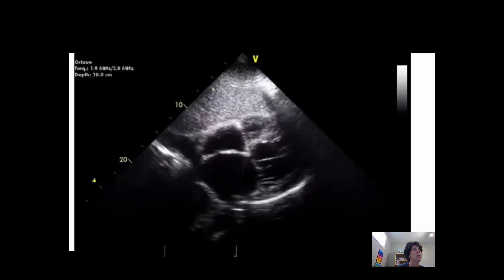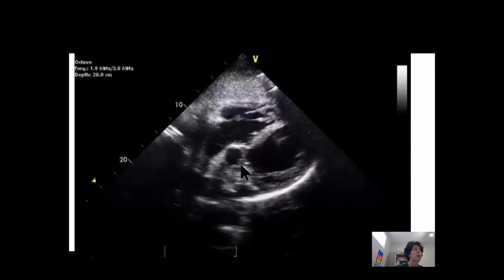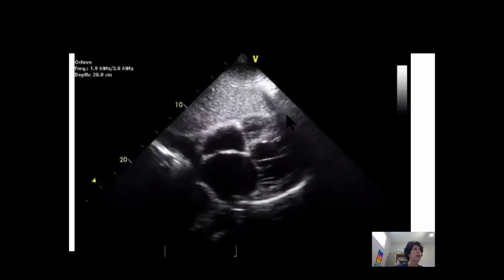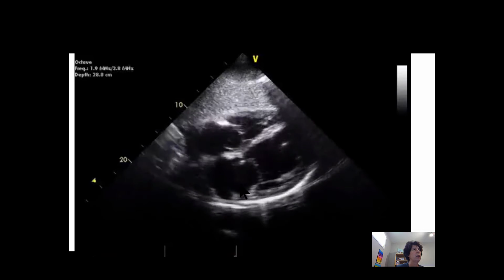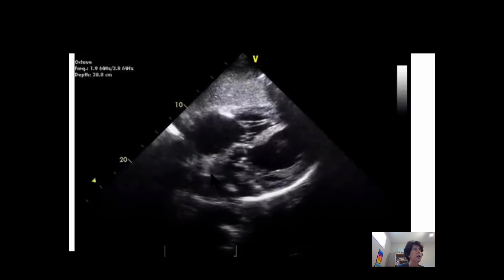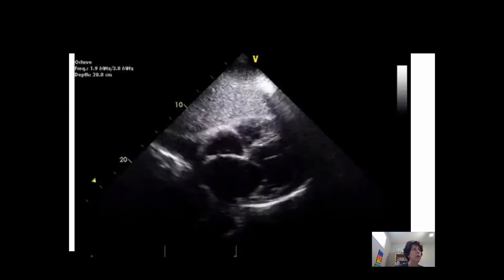Here we have our subcostal imaging. I'm going to get you to look at that again before I start speaking and tell me what you think. The structures here are LA, RA, RV, and LV. And the imaging is not completely optimal because we do slip from a 4 to a 5 chamber at times. But if we look at it while we have the 4 chamber view, I would suggest that this LA is at least moderate to moderate severely enlarged.